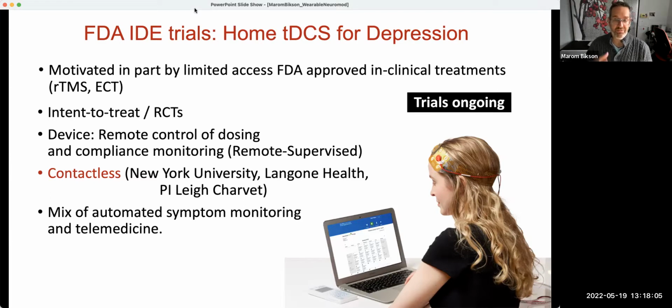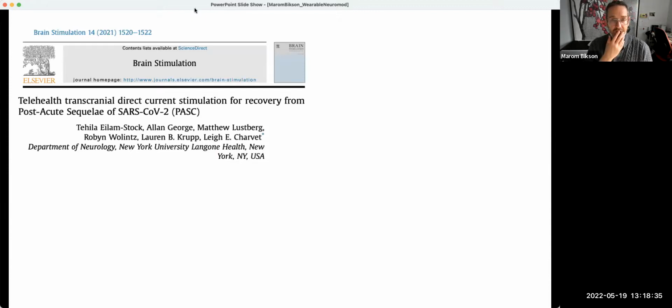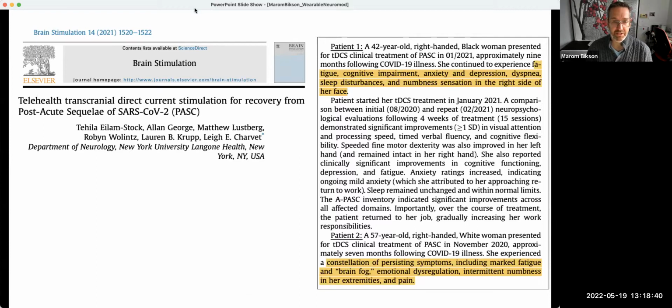So in some cases, you could have a piece of software where the intervention is pre-scheduled, 1 session per day, 5 days per week, after which they must complete the following 6 self-report questionnaires. All that is now being automated in the software. And so there is a lot of flexibility on how much manual or human interaction there needs to be, depending on how these trials are running. And these have now been extended to long COVID. There's several trials ongoing, and results have been sort of trickling out.